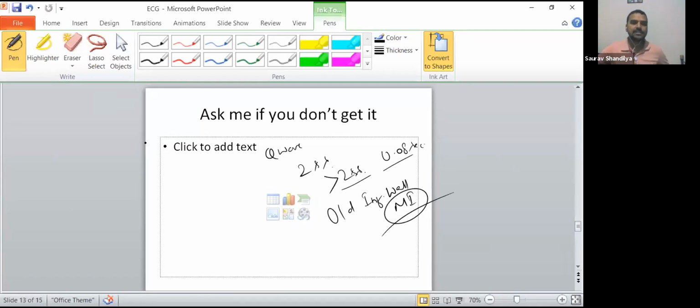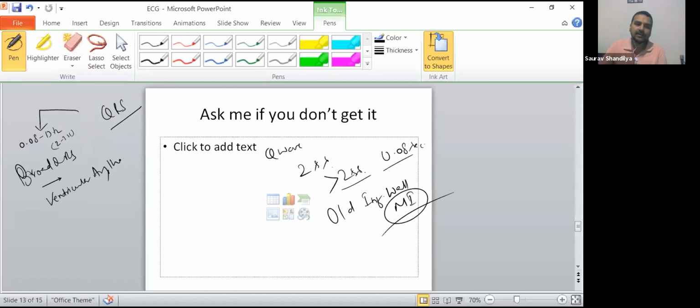Okay, next after Q, I will take it as the QRS complex. Very, very good to know, we can learn it in a little detail. It is about, as I told you, 0.08 to 0.12 second. So 2 to 3 small square boxes, right? So what happened here? If there is a broad QRS, okay, 100% ventricular arrhythmia. Now arrhythmia is of different types, like ectopic, tachycardia, fibrillation. That's a different story. So any pathology which disturbs the bundle of His will create the bundle branch block. And this could be of two types: right bundle branch block and left bundle branch block.